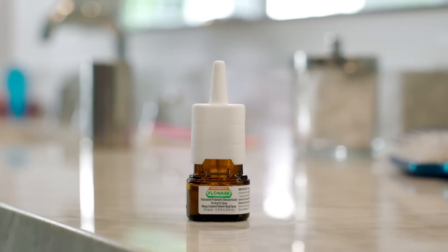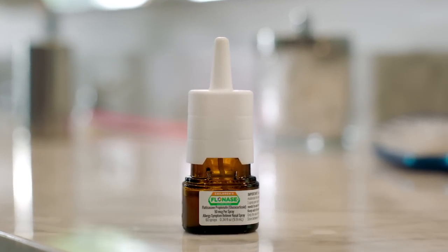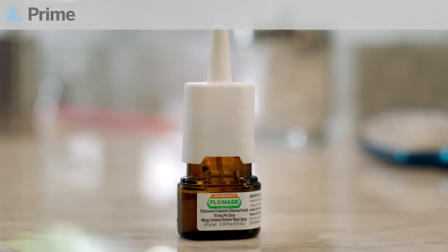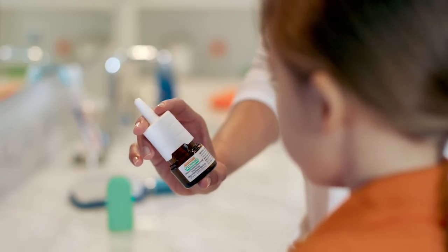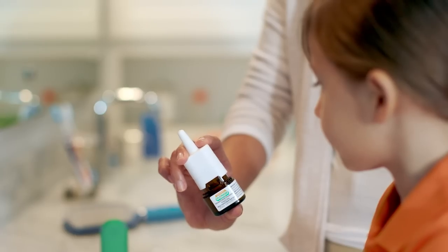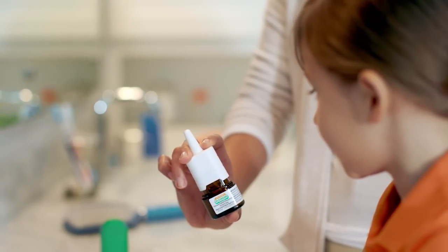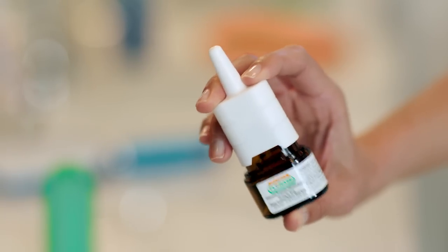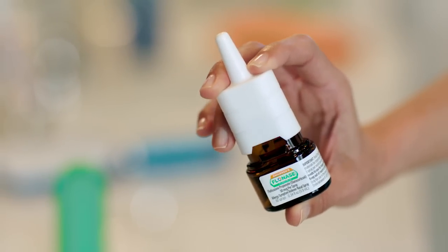If it's the first time you're using a new bottle, or you just cleaned the nozzle, or you haven't used it in a week or more, you'll need to prime the nozzle. Here's how: first, aim the bottle away from you and your child's face. Grasp the spray bottle like this. Then pump until a fine mist appears — that's how you'll know the bottle is primed for use. If you pump six times and no mist appears, the spray nozzle may be clogged and needs to be cleaned.